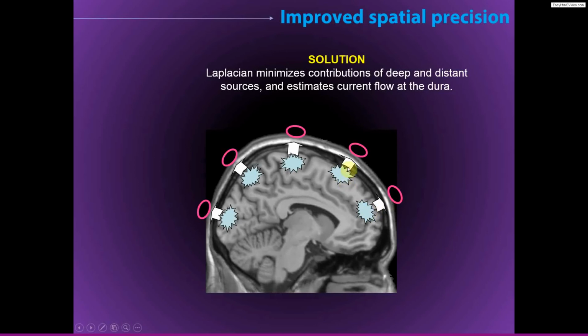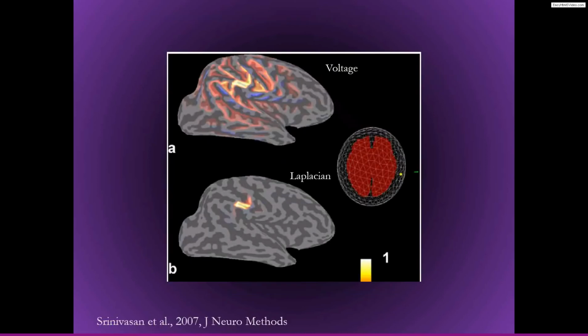This is not to say that the Laplacian completely eliminates volume conduction, but it certainly attenuates volume conduction by getting rid of these low spatial frequency components.